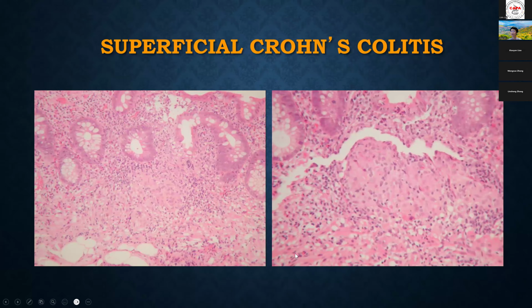But if you look carefully, we usually take a lot of sections for IBD, and we need to carefully examine every single case and pay attention to the granulomas. And we do see this kind of aggregate of histiocytes. They have oval or round nuclei and a lot of cytoplasm. They're pale or pink, right? Compared to the lymphocytes, they have a lot of cytoplasm, and they form a group. So that is a granuloma.